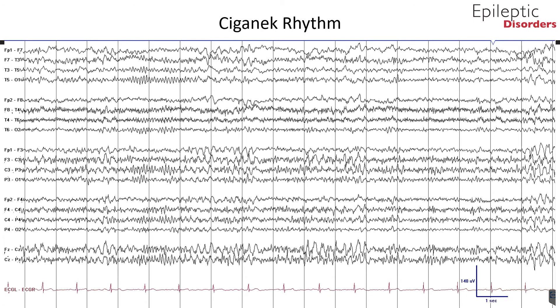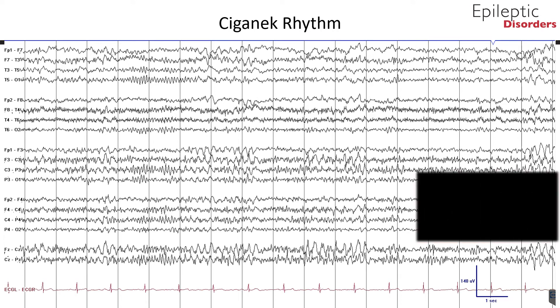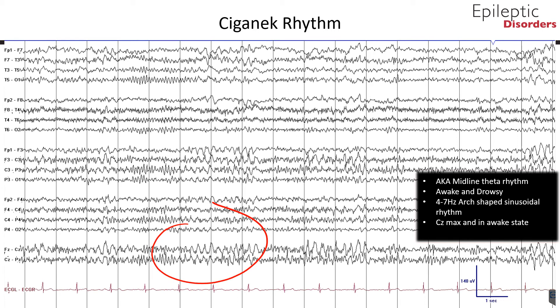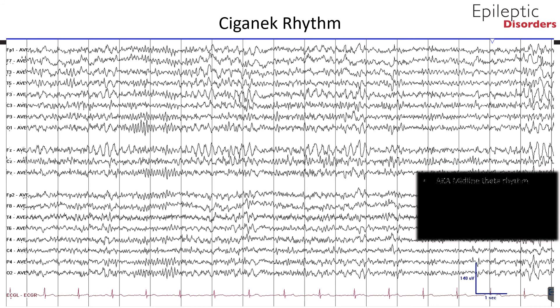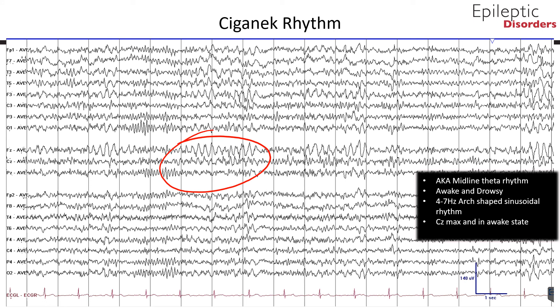The Ciganek rhythm, also known as midline theta rhythm, is seen during wakefulness and drowsiness. Similar to RMTD, the midline theta rhythm is typically a 4–7 Hz arc-shaped or sinusoidal rhythm that may at times be notched or flat-topped. The main difference in appearance from RMTD is the location, typically maximum over the CZ region, and the presence of Ciganek in the awake state. In this bipolar montage, you can see theta-range frequency maximum over the midline chains, especially over the central midline CZ. This is the same EEG shown in average montage, and you can see a midline theta rhythm with maximal amplitude over the CZ region. This is thought to be a normal variant.